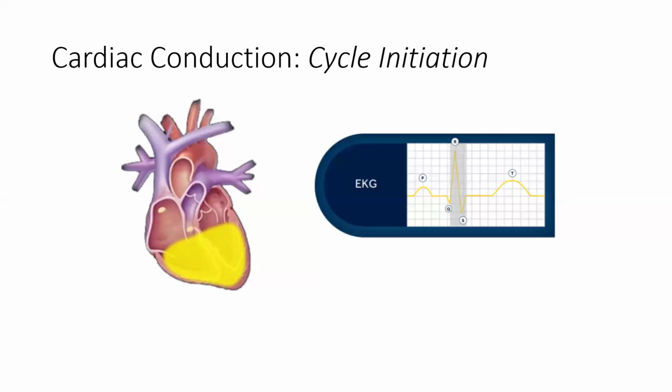As you can see, that color coding of yellow and, correspondingly, the QRS on the gray mark shows that there is activity happening in the ventricles. The QRS complex on the ECG represents the depolarization of the ventricular muscle mass. And remember that the muscle of the left part of the heart is quite enlarged because of the pressure it undergoes as it tries to push out blood from this particular part of the heart.